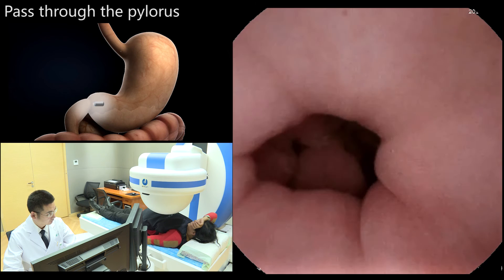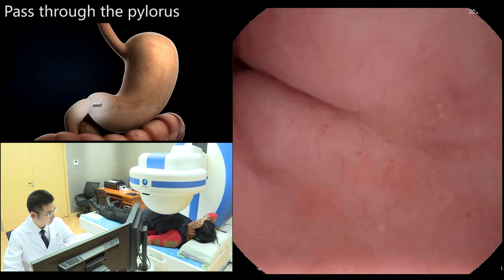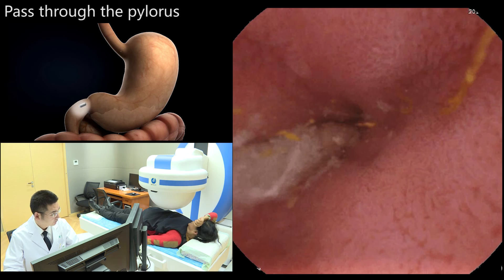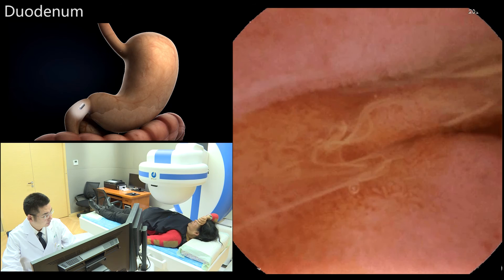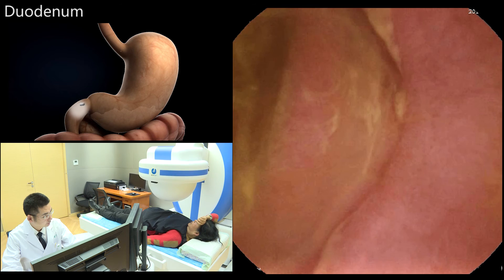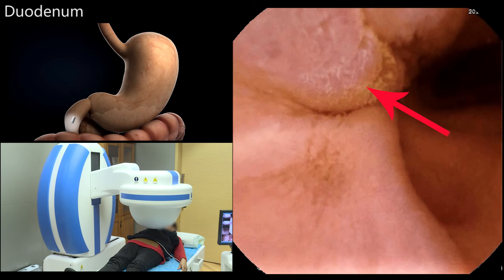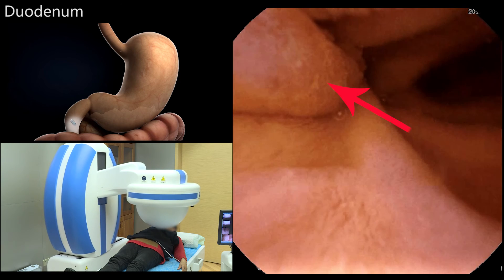Once the pylorus opened, peristalsis propelled the capsule into the duodenum. The magnetic ball was held vertically at the highest point and the 360-degree automatic scanning button was pressed to scan the duodenum automatically.